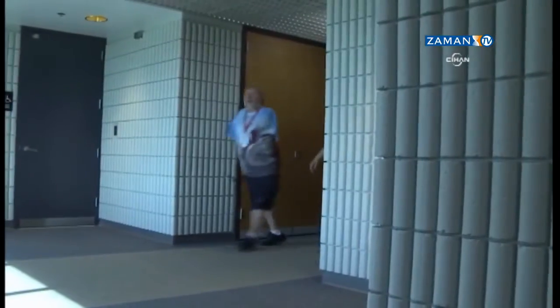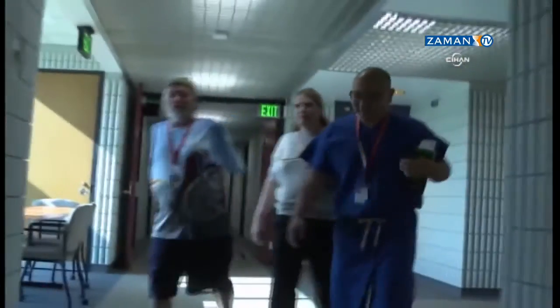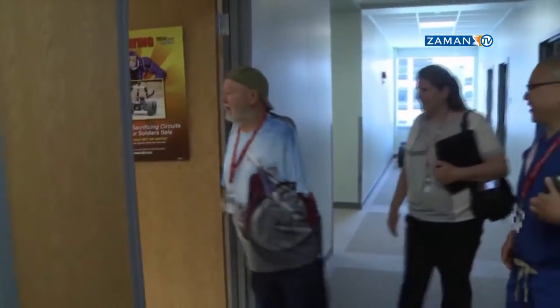To participate in an on-site field study with the Modular Prosthetic Limb, MPL, Les Baugh and his girlfriend were excited about the possibilities. Accompanying them is Dr. Albert Chi, as part of the interdisciplinary team from the Johns Hopkins Hospital.